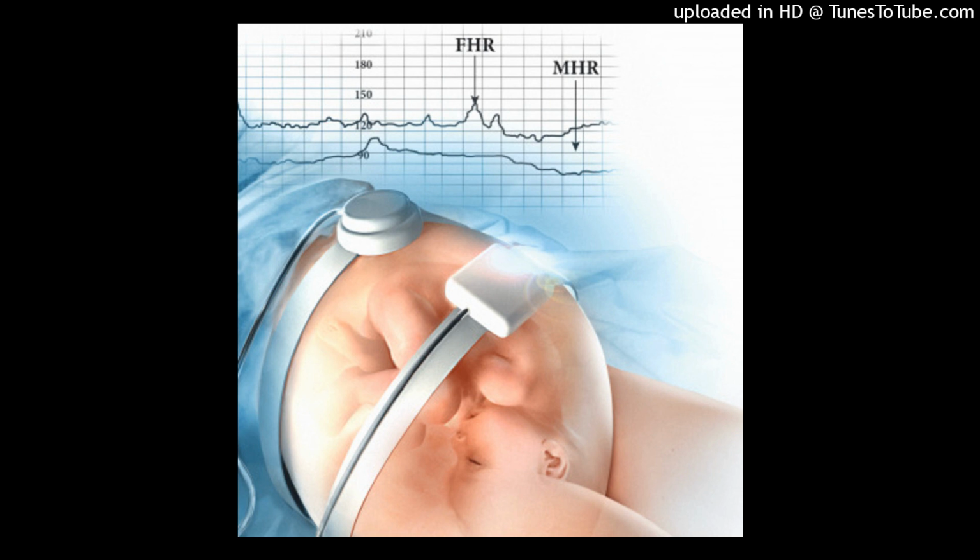Electronic fetal monitoring instrumentation. Intermittent auscultation, IA, of the FHR and palpation of UA were the only methods of fetal assessment until the introduction of EFM in the late 1960s. By the late 1970s, EFM was estimated to be used in over half of U.S.